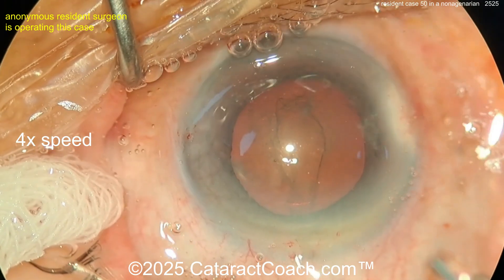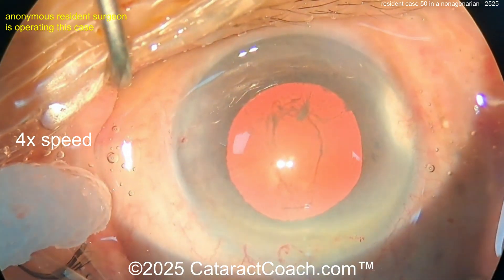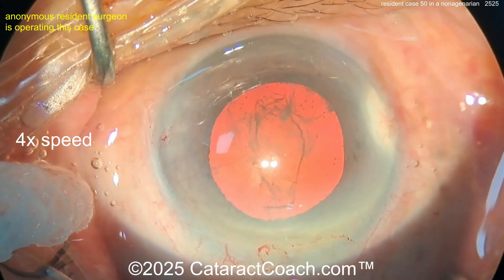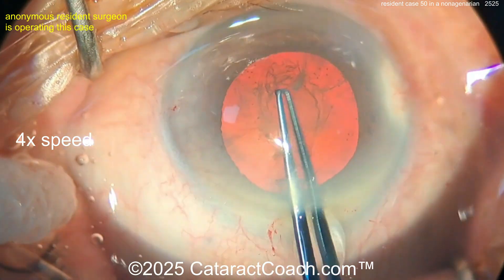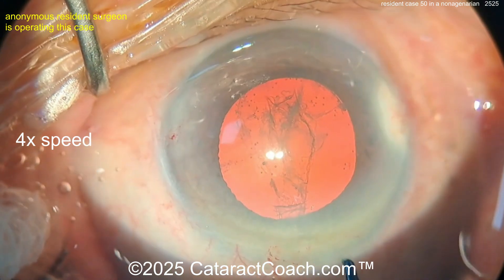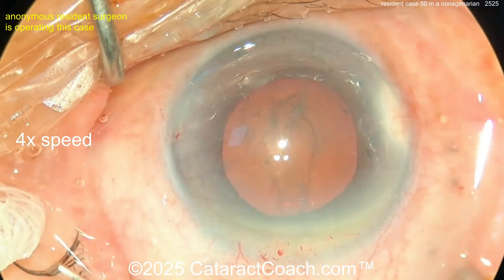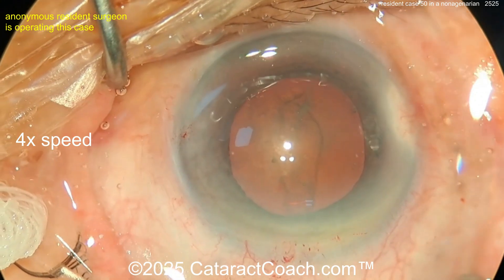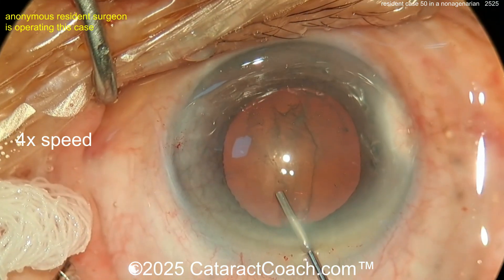You can see on the left side of the case a little sponge helping suck off fluid from the surface of the eye. The surgeon is adjusting the microscope lighting to emphasize the red reflex. You can see the two Purkinje images in the center of the cornea, which indicate coaxial lighting. You also have the paraxial light on — all three lights are on at the moment.